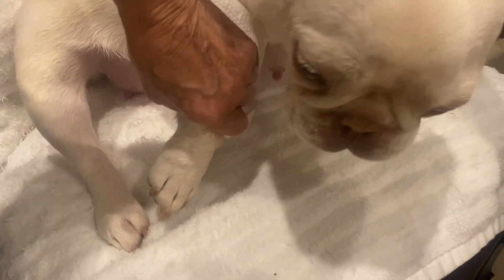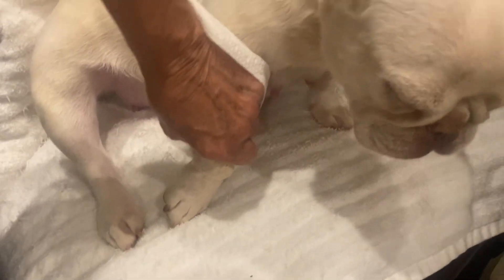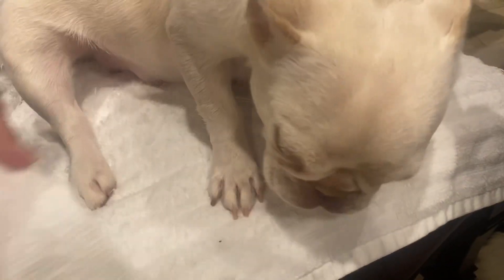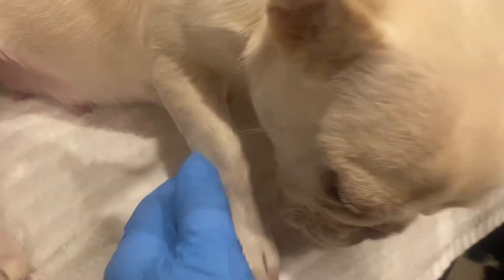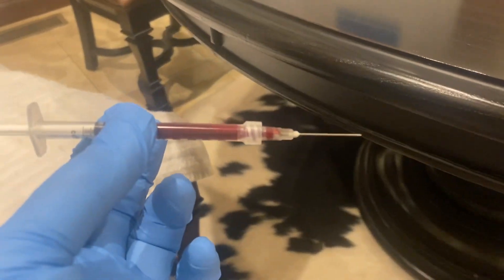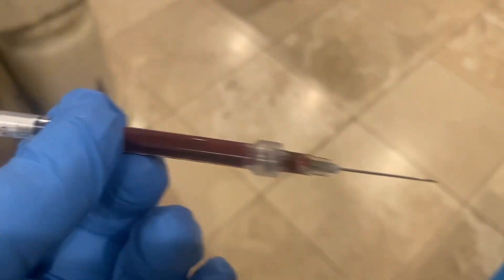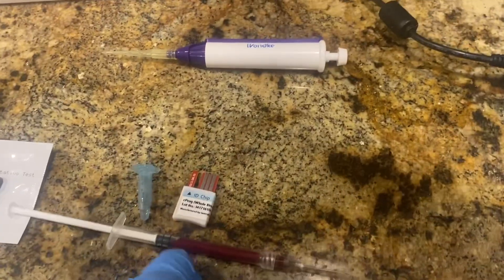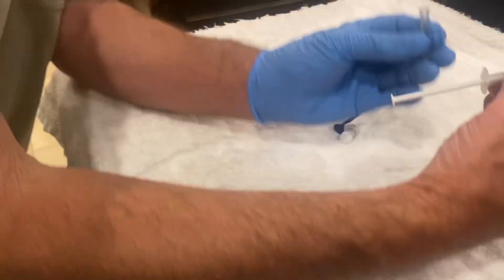Put your finger on it and apply pressure. I made that look easy — if you haven't done it before, I promise you'll have some sweat doing it a few times, but you won't hurt your dog. Check if it stopped bleeding — look at that, not in any blood at all. Beautiful. She can go back in the cage. We just saw us pulling the blood — here it is.